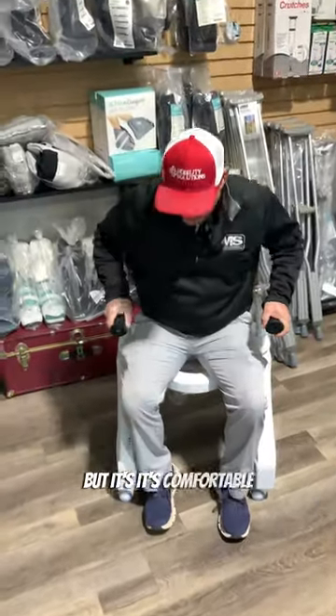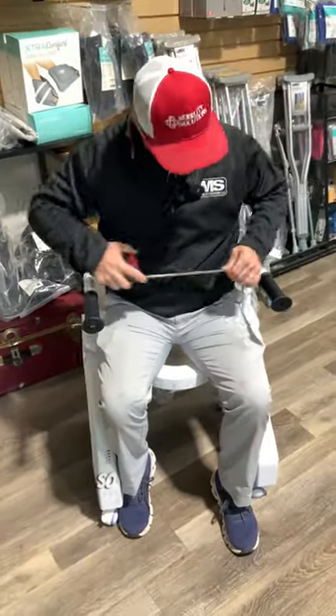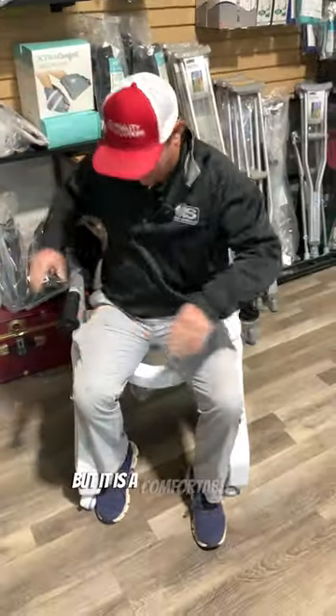It's comfortable, and the space in between the arms is kind of important. Between the arms is about 18 inches, and it is a comfortable seat.